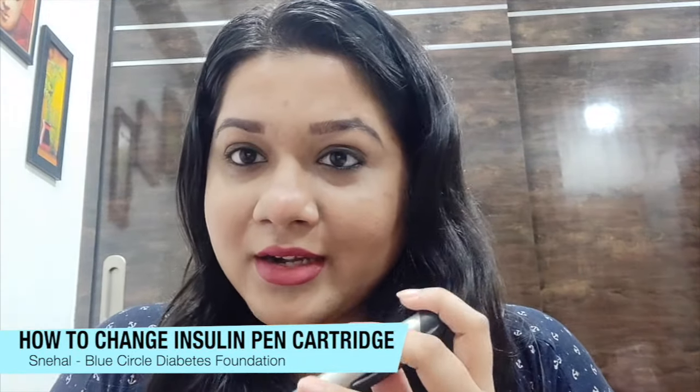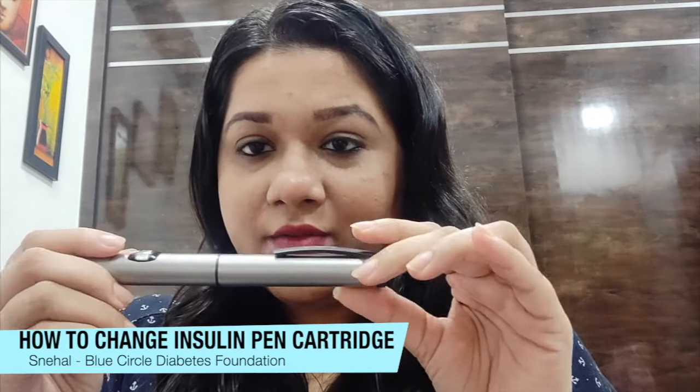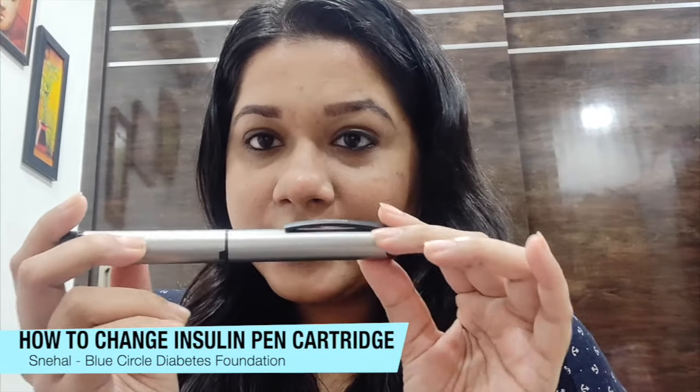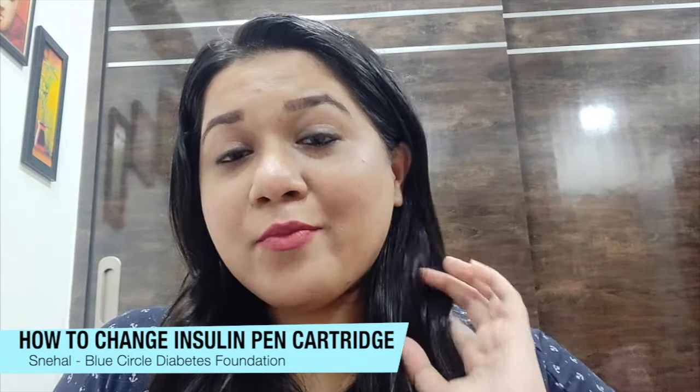Before I start, the most important thing to ensure is that you have a cushion or a pillow beneath your pen when you're trying to remove or add the cartridge, or that you're sitting on a bed — so that if by mistake your cartridge falls down, it doesn't break. Personally, I've made that mistake twice and it's really hurtful to see the cartridge break into pieces.